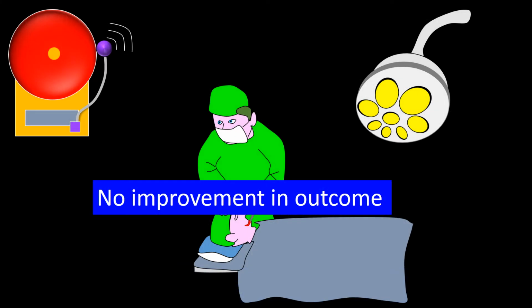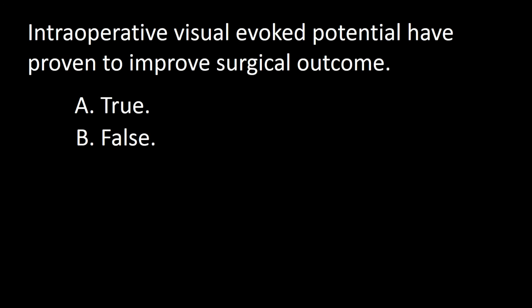Having said all that about intraoperative VEP, it is important to remember that statistically, with the protocols that are being used at the moment, intraoperative VEP has not been shown to make a difference regarding outcome. The hope is that better protocols in the future will change this. So the answer to this question is B.